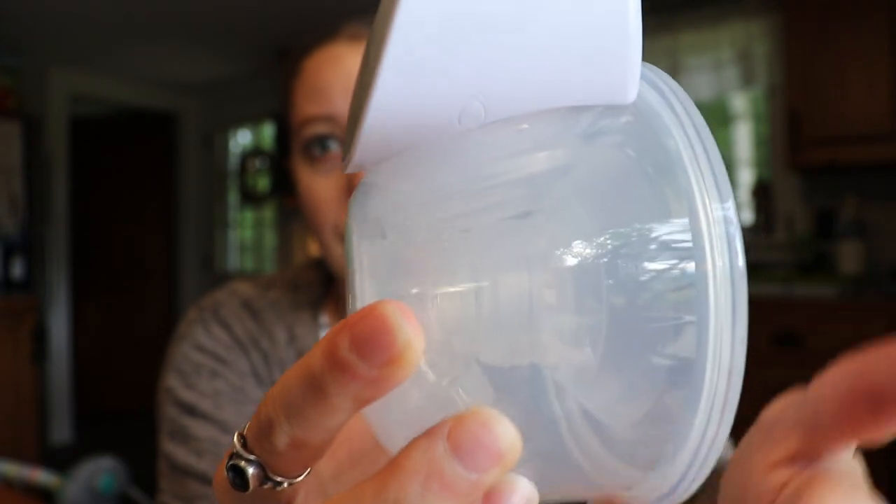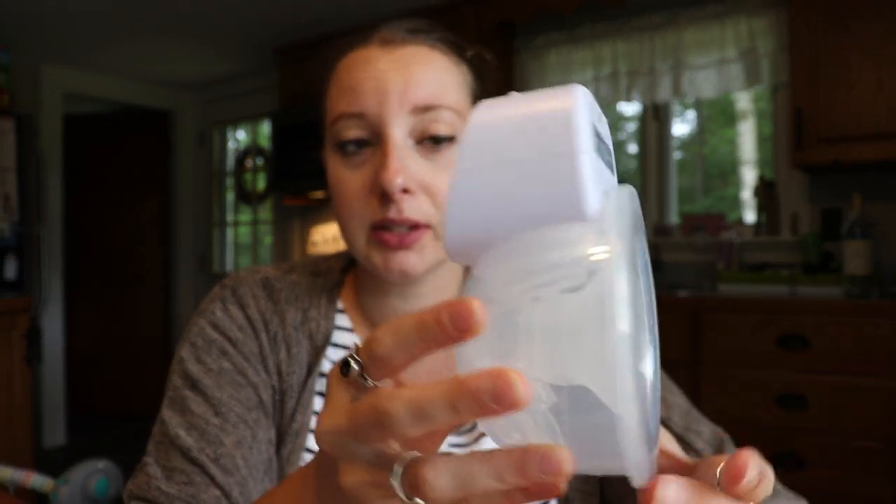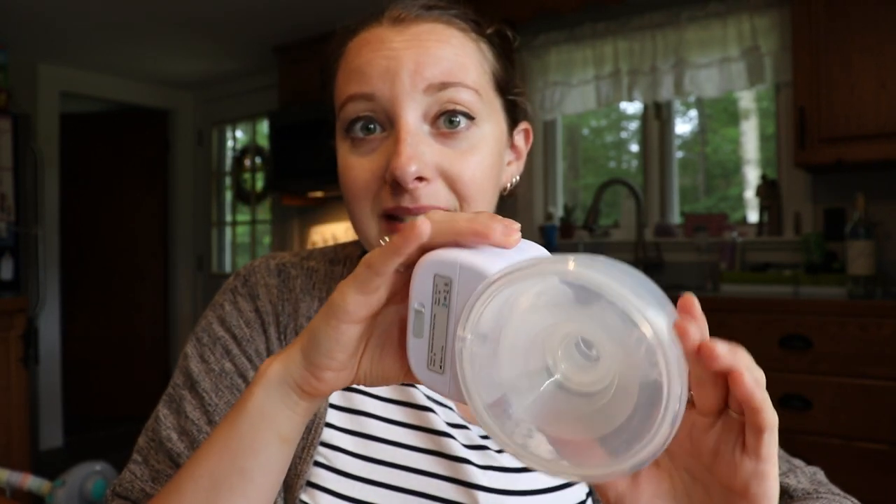On the side you can see there are ounce level markings. I don't think those are very accurate, but it's nice that they're there. It is hard to tell what you have when there is milk in there. This pump retails for about $60 to $65 on Amazon and I think it's the same on their website as well, which is a great price point. That was one of the big selling points for me — I really wanted to try the Willow pump but I really don't want to spend $500. I feel like that's a ridiculous amount of money, and the fact that this company came out with a pump that's a million times cheaper is awesome.